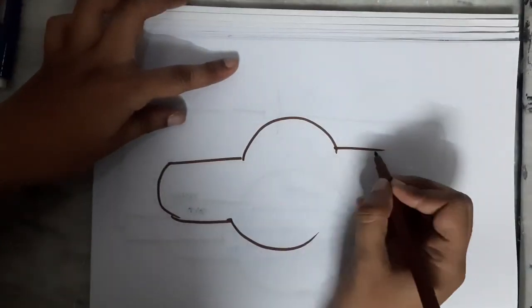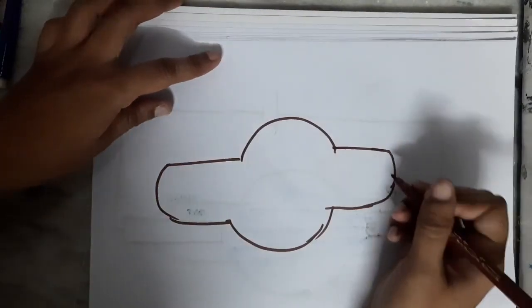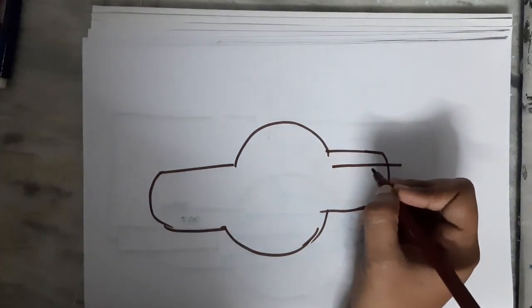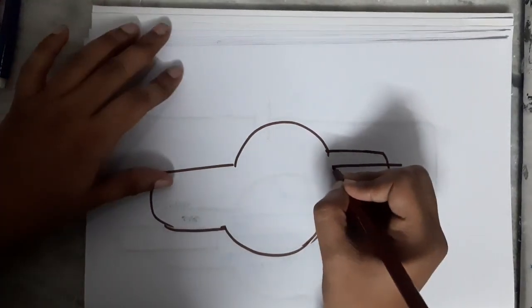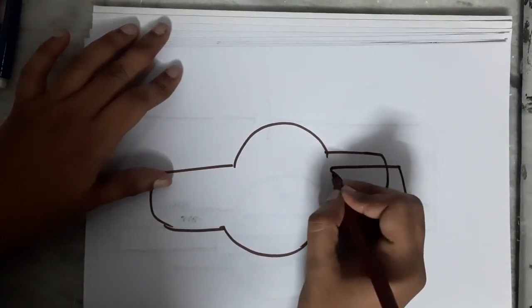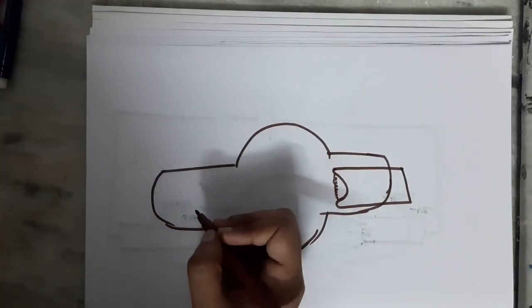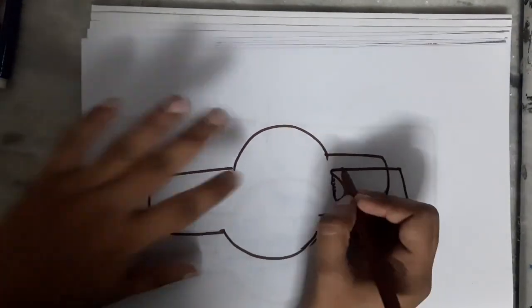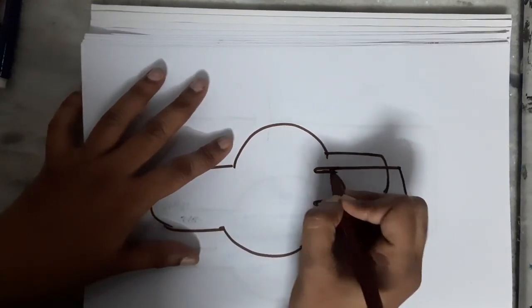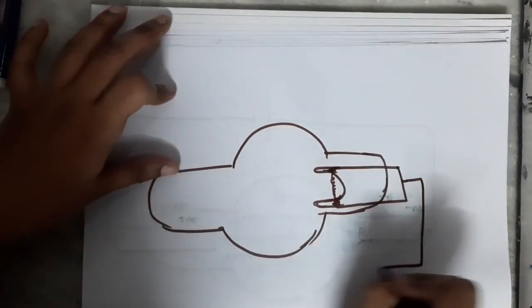So I am drawing the same tube. I must have used black color, but okay, this one I am using this color. They have put something called a focusing cup, and in this focusing cup, they have put the tungsten filament. The tungsten filament is kept inside this focusing cup like this. The focusing cup is like this, and they have put the tungsten filament inside the focusing cup.